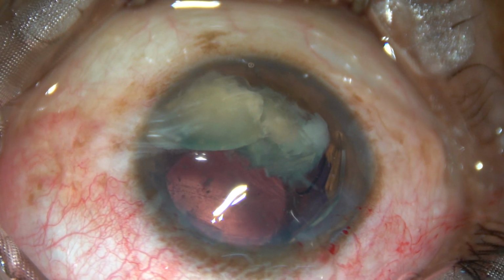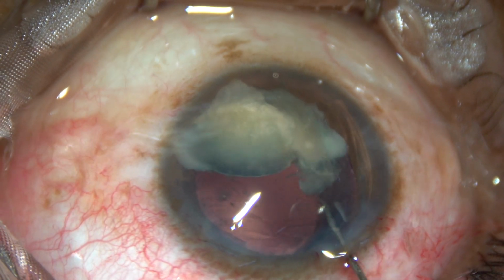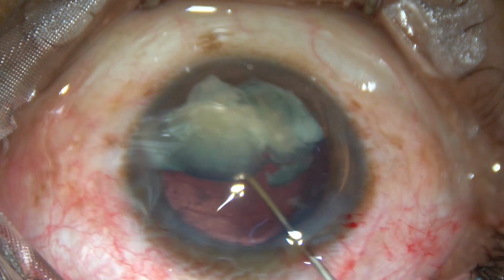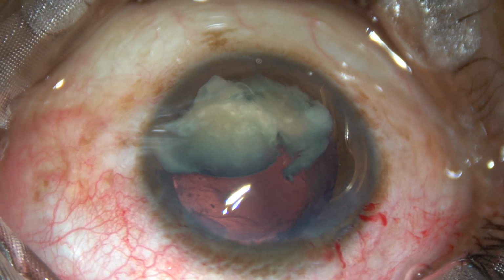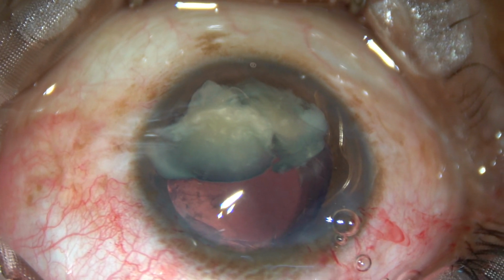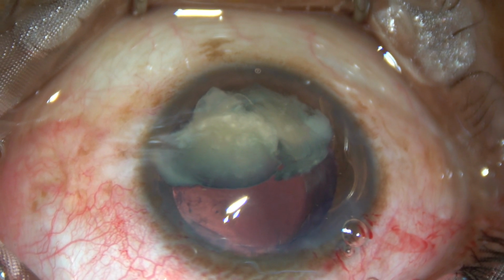And now in this case what has happened is the leading haptic has gone into the capsular bag and the trailing haptic is over the iris at around 9 o'clock. Now I am going to use the phaco handpiece and emulsify these two nuclear pieces.